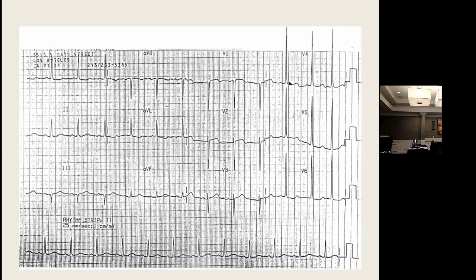The other thing that makes this LVH is what you guys might recognize as lateral ischemia. ST depression, a little bit of coving of the waveforms, just not quite normal. Okay, not really classic for ischemia, but that's strain. Strain, I like to think of it as, if the ventricle has gotten so hypertrophied, the repolarization is going to change. It's a repolarization variant associated with this hypertrophy. And the specificity of this is 95%. That's really, 95% specificity for anything is a really high number.